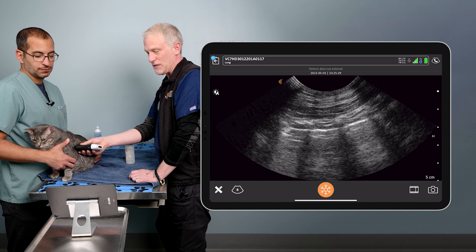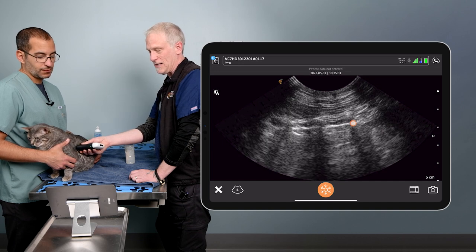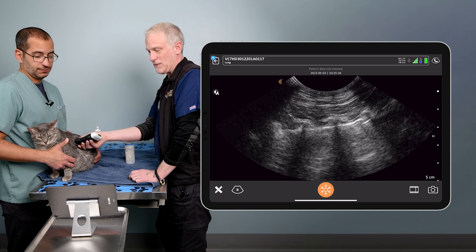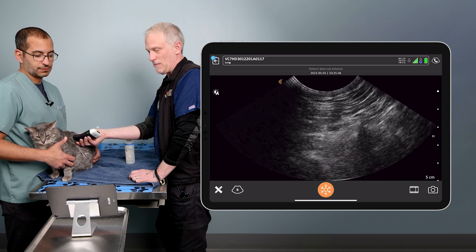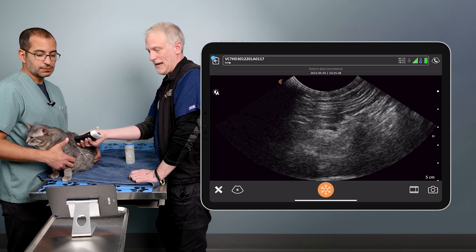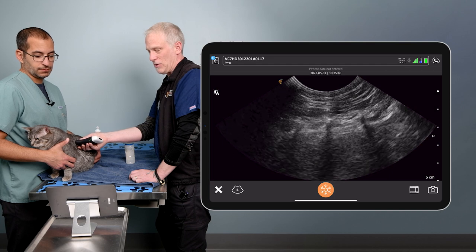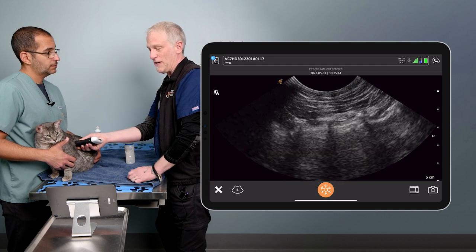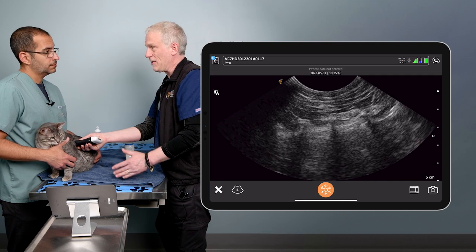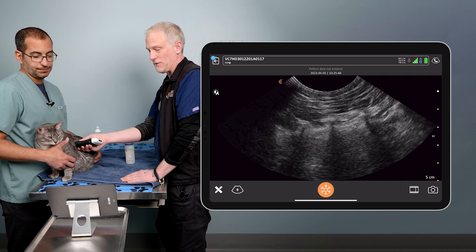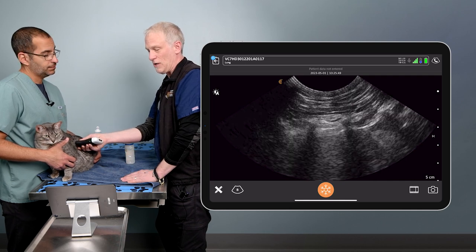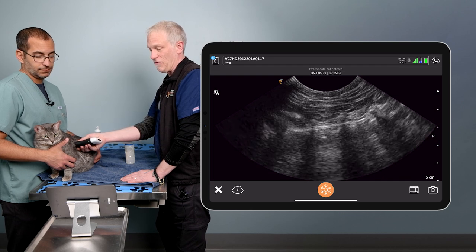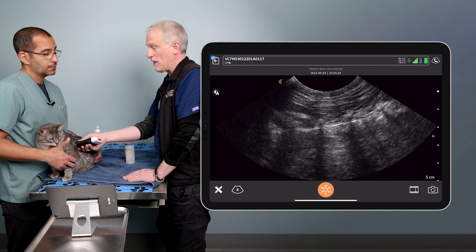Now we move to our caudal border, sliding back until we see that curtain sign, then following it dorsally until the pleural line disappears into the sublumbar muscles — that's our dorsal border and caudal border. We come back down until we just see that pleural line again. That is our most caudal dorsal site with confidence, because you can still see the caudal border and the dorsal border transitioning to sublumbar muscles. Going more caudal and you're in the abdomen. This is with confidence our most caudal dorsal site to look for free air in pneumothorax.